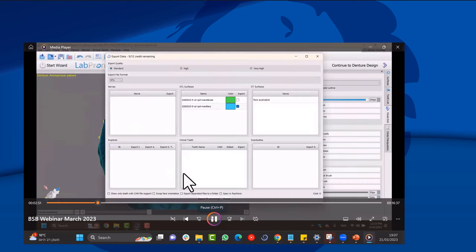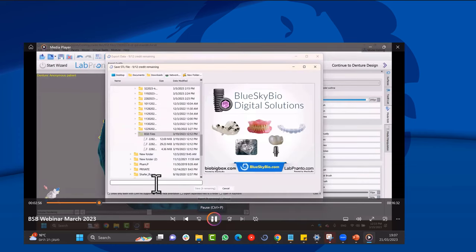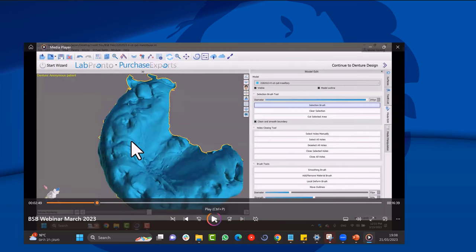There's an isolate button function that the host mentioned — you click on what you want to keep and everything else disappears, which might be a more efficient shortcut. The speaker was unfamiliar with it but will look into it. This illustrates that you tend to learn one way of doing something and stick with it, even though there may be better approaches.